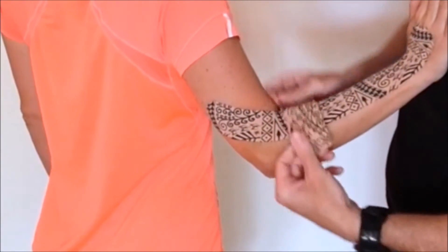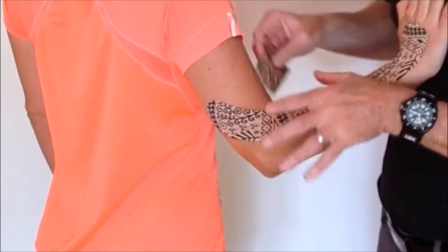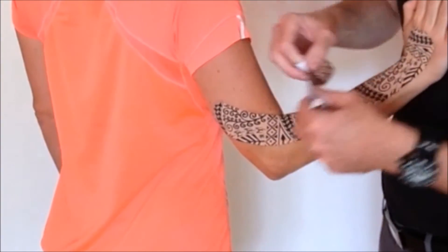I don't want to start in the middle and come down either side because that's just going to give me lifting of the skin. I want to start on one end and then use my fingers to really pull all of that soft tissue together to create that boxing effect.